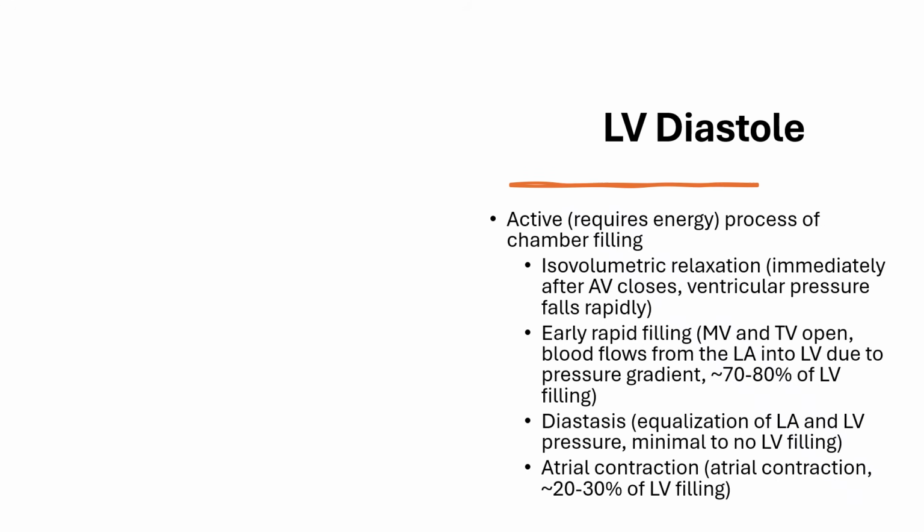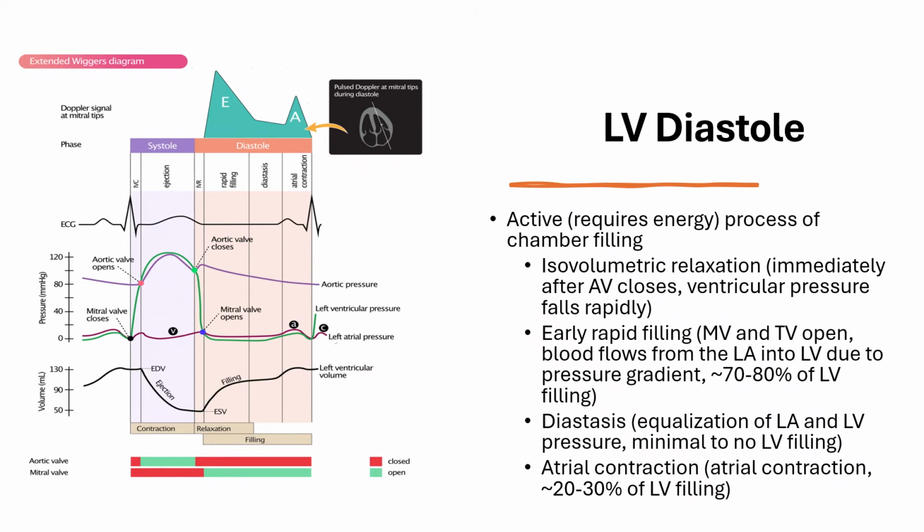an atrial contraction phase. On this slide here on the left, you see a diagram showing different phases of diastole corresponding to different EKG parameters and LV filling. Please pause this video if you need more time to review this important concept.